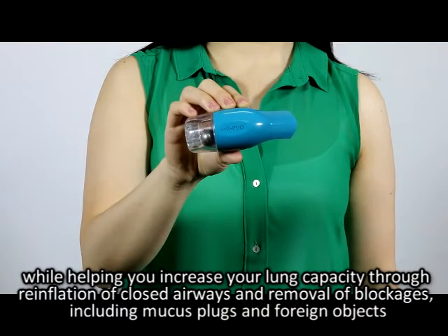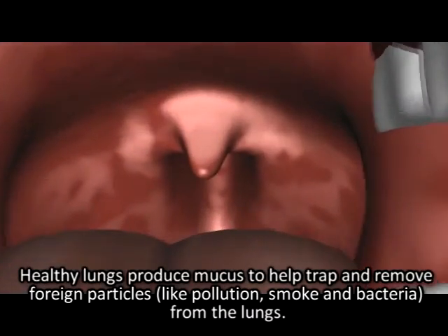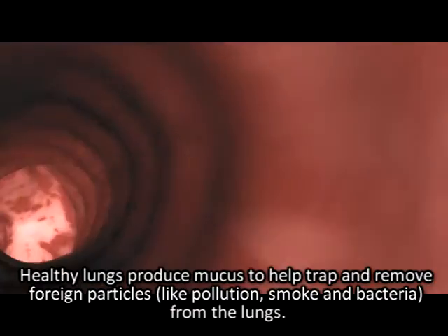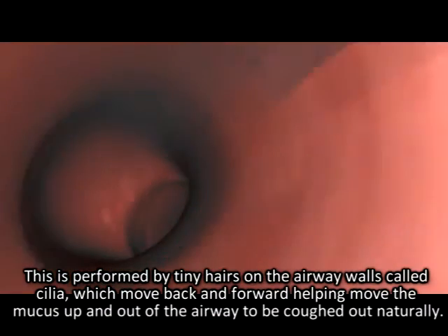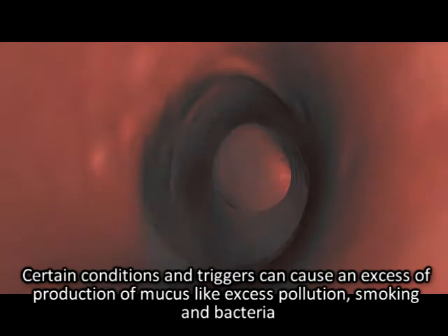Including mucus plugs and foreign objects. Why is Air Physio Clean My Lungs needed? Healthy lungs produce mucus to help trap and remove foreign particles like pollution, smoke, and bacteria from the lungs. This is performed by tiny hairs on the airway walls called cilia, which move back and forwards helping move the mucus up and out of the airway to be coughed out naturally.